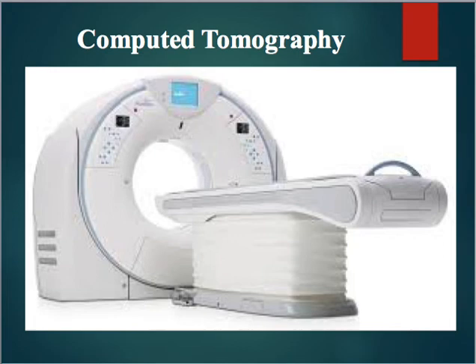So again, like I said, CT scanning is just a series of X-ray images. It uses X-ray technology taken from different angles around our body. And then it's using that computer technology to reconstruct those images into cross-sectional images or slices of the anatomy. So CT is very fast, it's very patient-friendly, and it has the unique ability to image a combination of our bone, our soft tissue, and our blood vessels, which isn't something that a lot of modalities have.